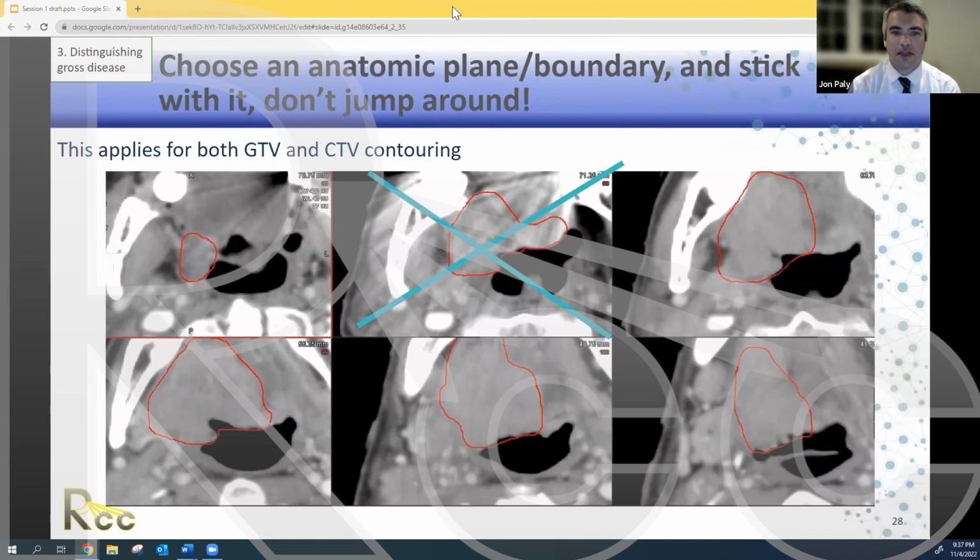Yeah, so in a post-op pelvic case, for example, for GYN, if we're not especially concerned about there being leftover nodes and they've had a diagnostic scan, for our treatment planning scan, we're really just contouring the vessels. And so typically I would just use a non-contrast scan for that. Same with the rectal, if it was a post-op rectal.